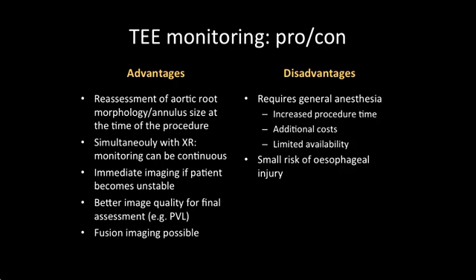We favor the use of transesophageal monitoring during TAVI procedures at our institution, as it provides continuous high-quality monitoring throughout the procedure. It is particularly useful in cases of hemodynamic instability, and it often provides better imaging quality for final result assessment than transthoracic echocardiography. It can be of importance for detection and grading of a residual paravalvular leak. Finally, the presence of the 3D probe allows fusion imaging with fluoroscopy, which may be valuable for complex structural interventions.